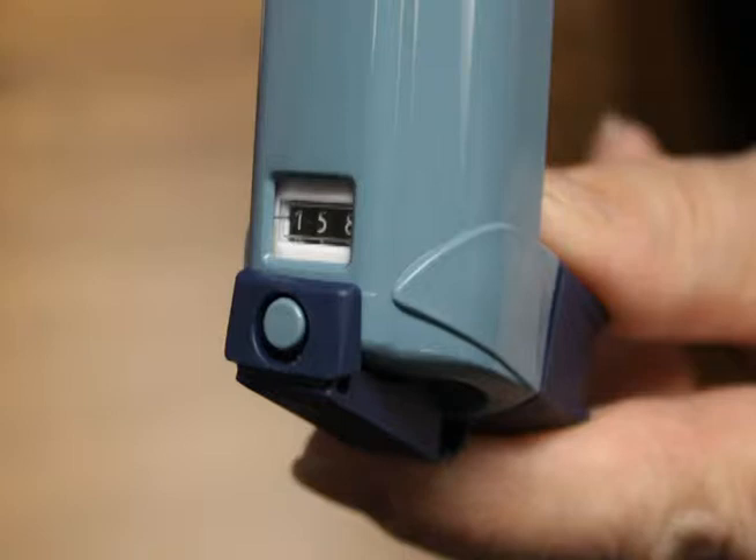If your inhaler does not have a dose counter, ask your doctor or pharmacist for ways to know when your inhaler is out of medicine and you need to get a new one.